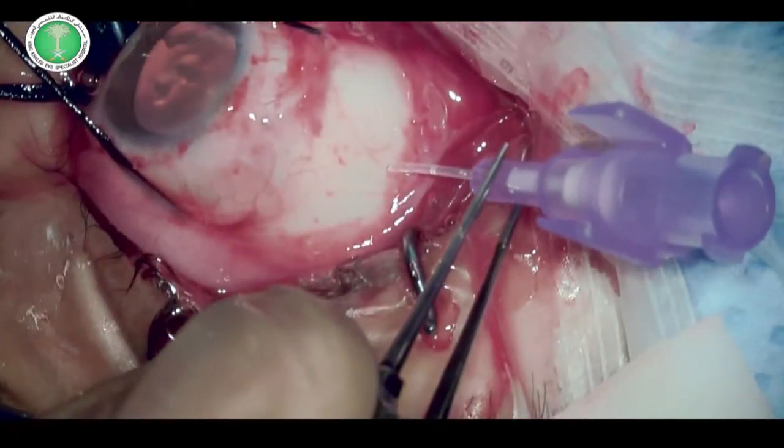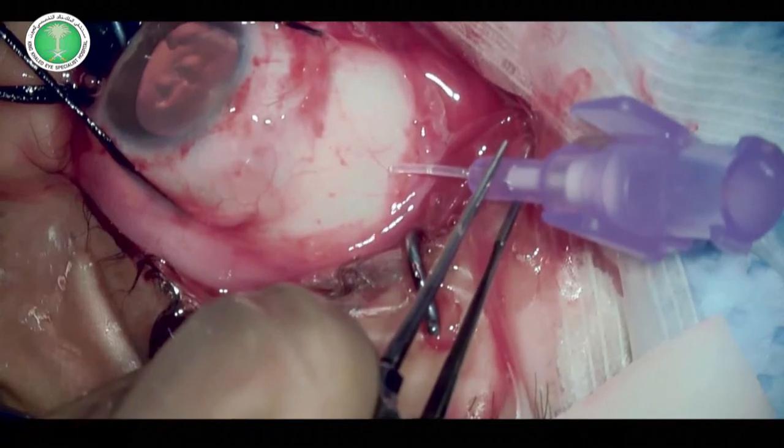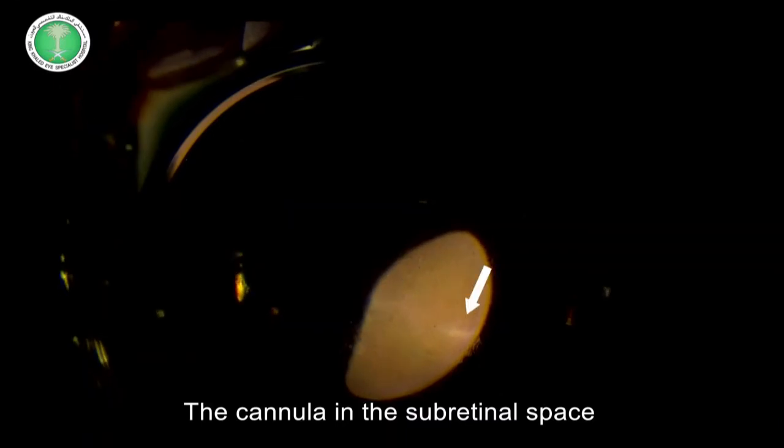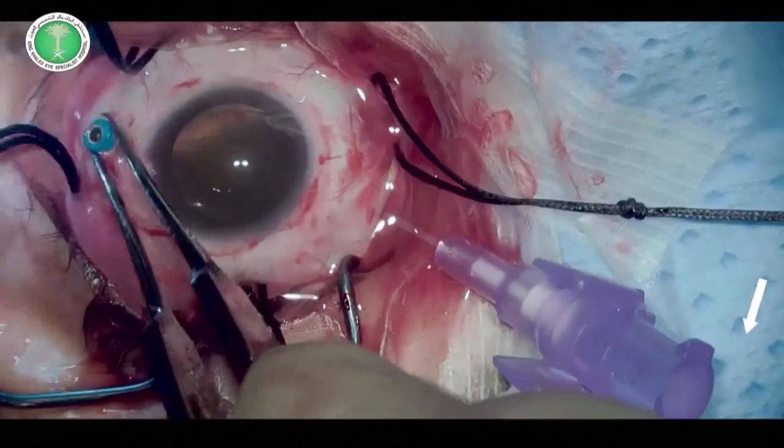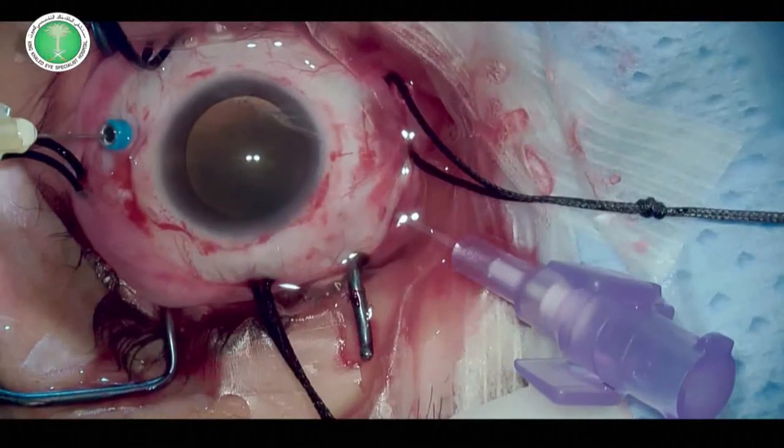The passive subretinal fluid drainage can be observed through the hub of the cannula, and this is the cannula in the subretinal space. Subretinal fluid drainage can be assisted with the injection of BSS through the microcannula of the chandelier light.